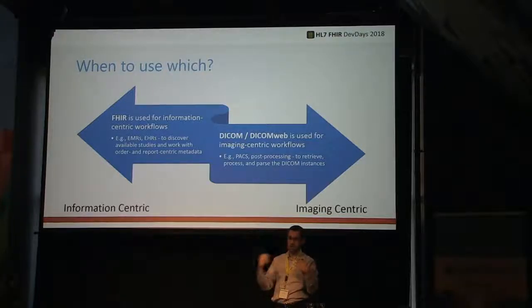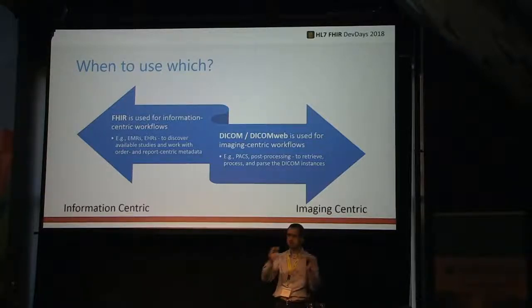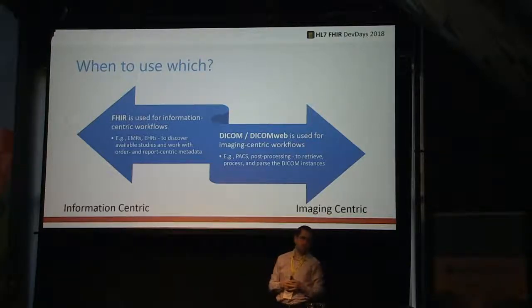My background is actually in desktop integration, so synchronization between multiple applications. And this is probably one of the most obvious ones where you see the difference. A radiologist uses PACS to drive the entire workflow. Everybody else in the hospital will probably use the EMR, EHR to drive the workflow, right? They will only click to see images when they want them. So that's typically the difference. Is that clear for everybody? Very good.